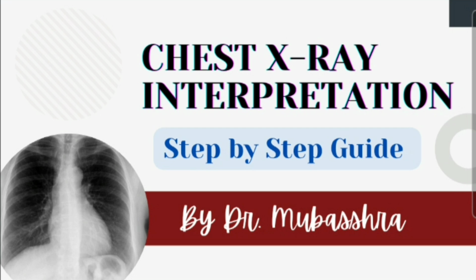This is Dr. Mubasshra, and in this video I have come up with a structured approach to chest X-ray interpretation. The purpose of this video is to make chest X-ray interpretation as easy as possible. This video will be useful for all medical students, including MBBS undergraduate students, house officers, medical officers, as well as postgraduate residents. So please watch my video till the end to learn chest X-ray interpretation step by step.